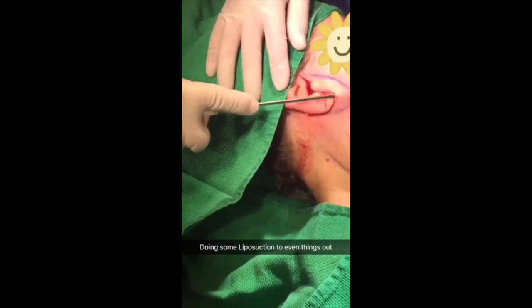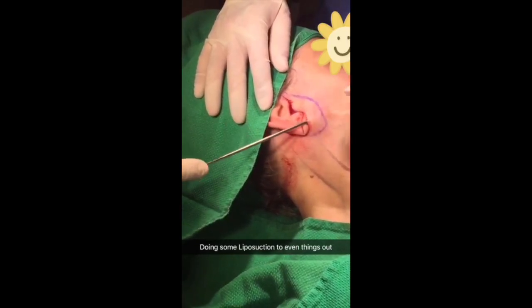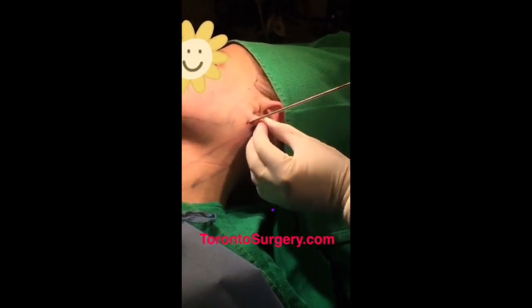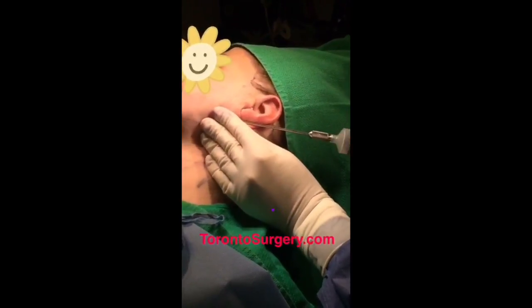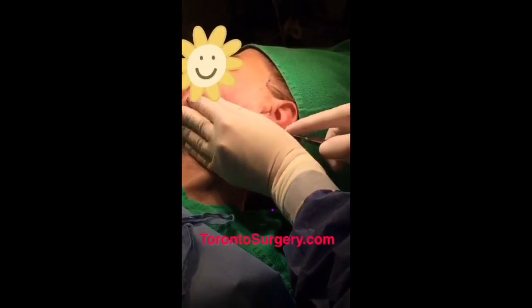We'll go to the liposuction along the jawline here. Are you feeling any pain? No. Nothing? No. Great. Do a little liposuction on the other side. You feeling anything? Not yet.